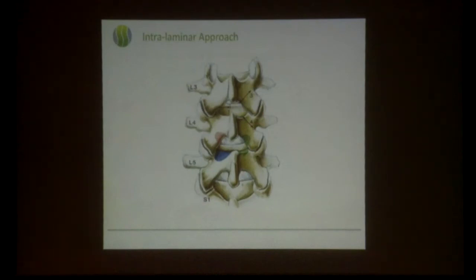I think with the transforaminal approach, other than cauda equina, which presents with urinary and bladder loss, I will not do cauda equina. Otherwise, all the discs can be done through the transforaminal approach. But some people do more of this. It has got its own place and indications. I will go for that.